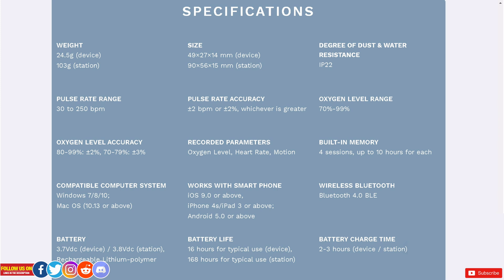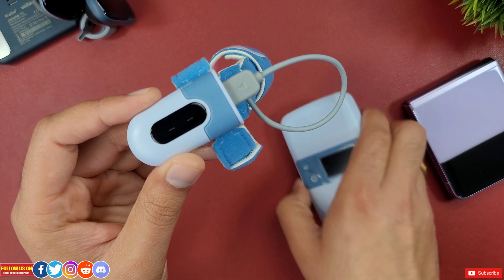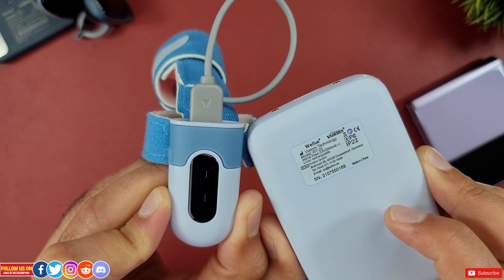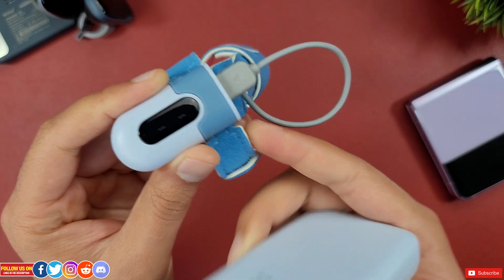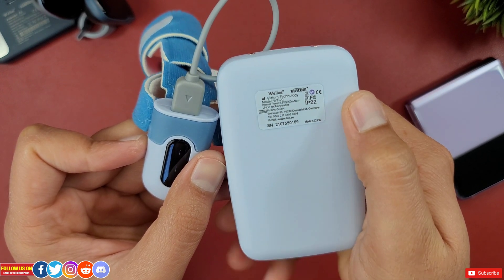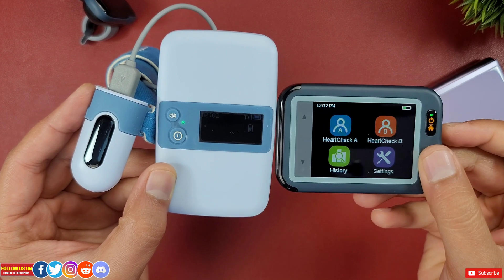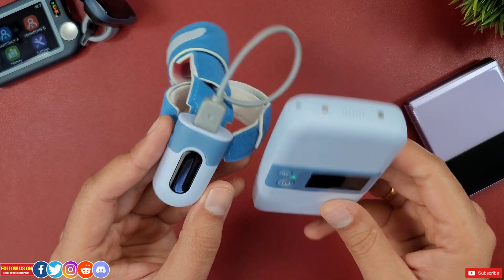In terms of battery life, both the device and the base station have lithium polymer rechargeable batteries — no need to change battery cells, just plug them in. The device itself has a 16-hour battery life, which is accurate from testing. The base station is rated at 168 hours. Honestly, since using this device, I've never had to charge the base station.